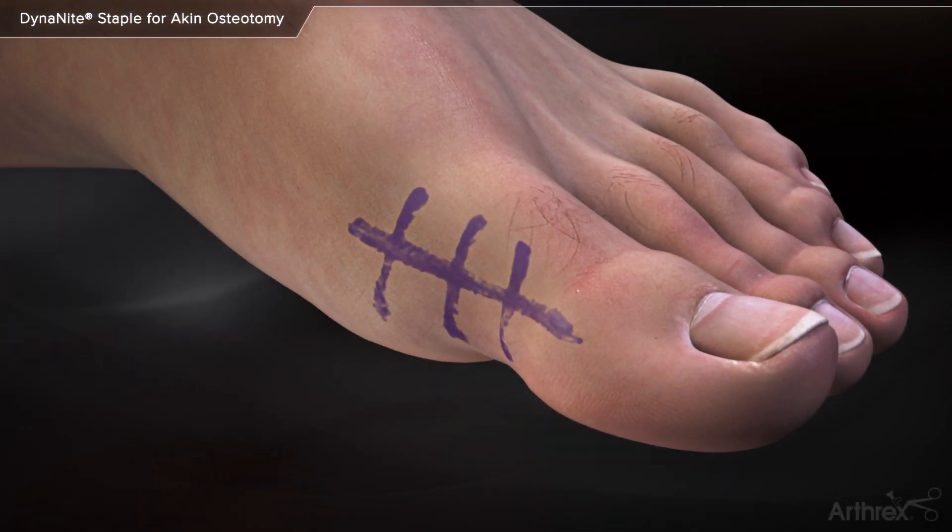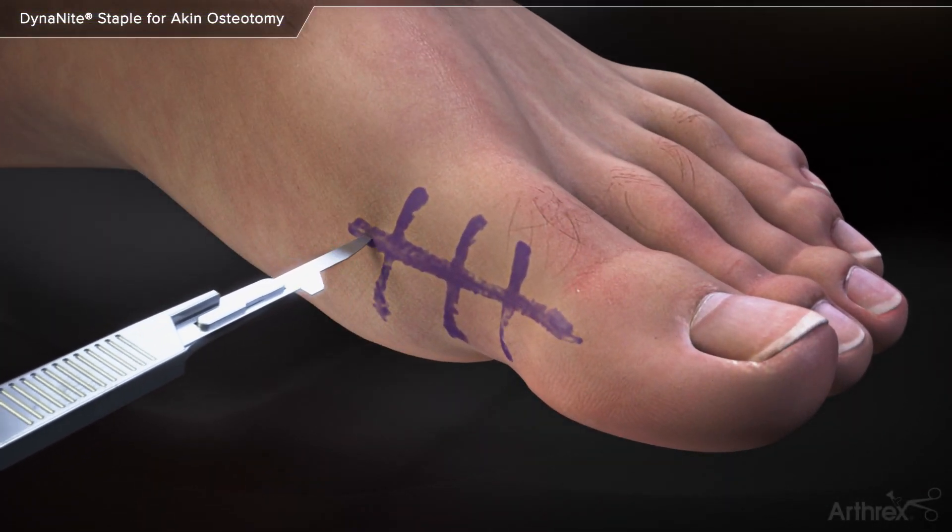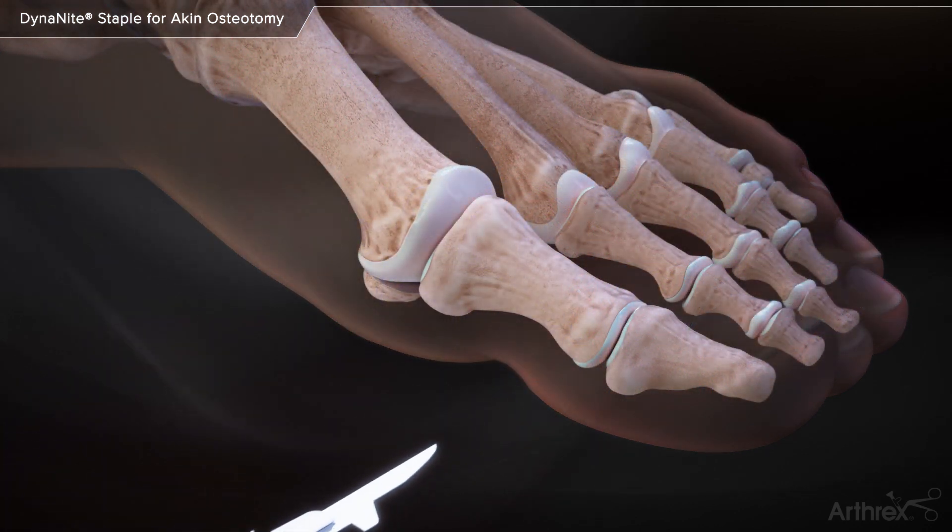Dynanite Staple for Aiken Osteotomy. A linear incision is made horizontally over the proximal phalanx of the great toe.